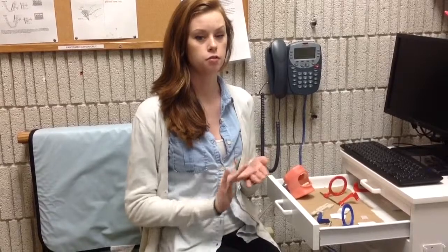Taste is also a factor with children. If something does not taste right, they will not keep it in their mouth. So what you can do is use a lollipop when taking anterior films, having the child lick the lollipop and then sticking the film onto the lollipop and holding the lollipop in the place where you need to take the x-ray. Also, you can use toothpaste when taking posterior x-rays. You can rub the toothpaste on the back of the film. That way the patient tastes the toothpaste and not the film.